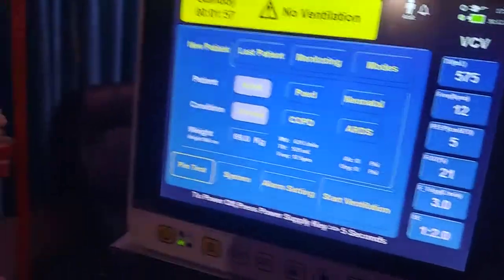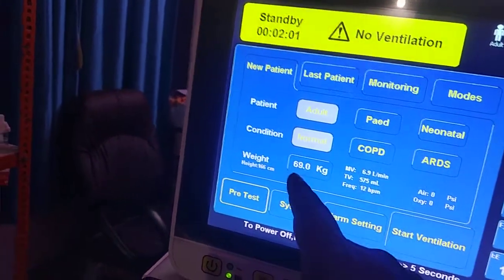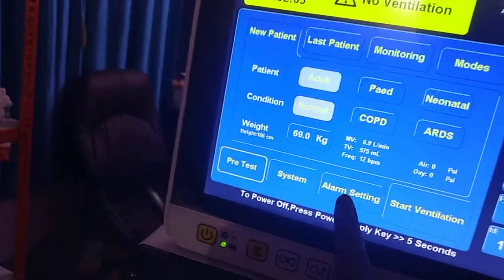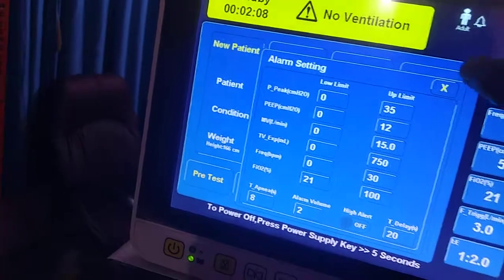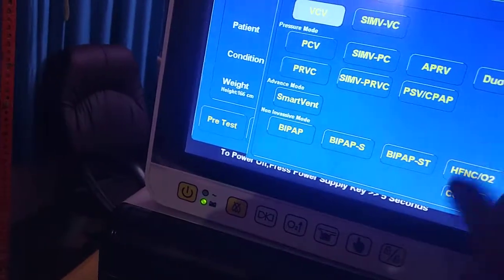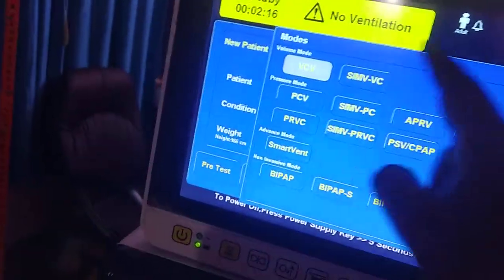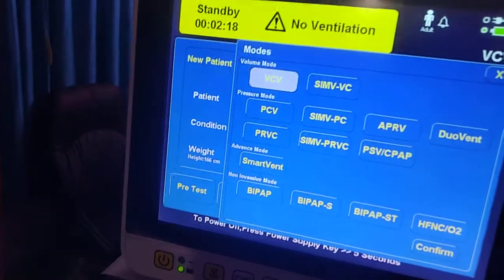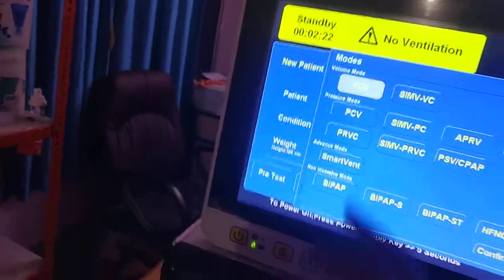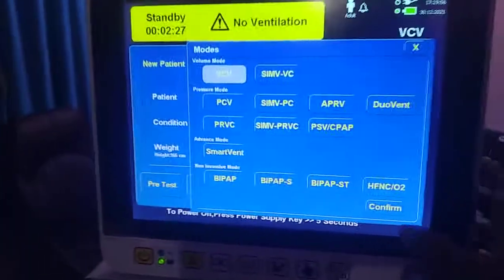To start ventilation, select your patient type, lung condition, and body weight, then start directly. If you wish, you can also set alarm limits beforehand. You can also select the ventilation mode from this screen — for example, Volume Control, Pressure Control, or any other mode you want to start with.